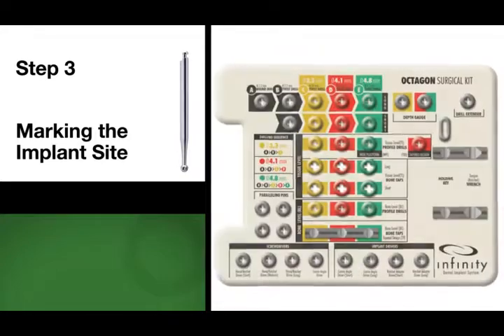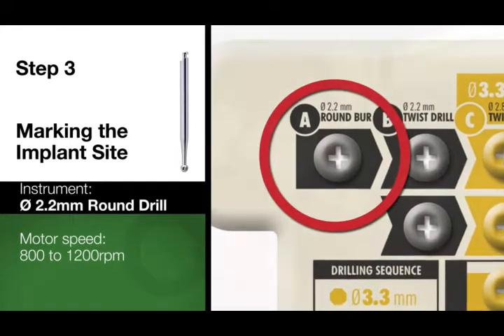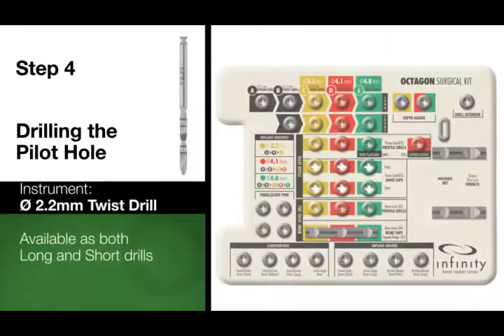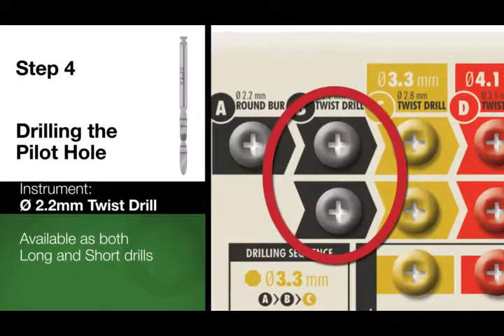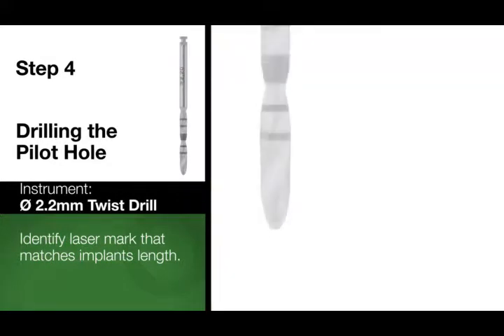Step 3. Marking the implant site. Use the 2.2 mm diameter round burr with a motor speed between 800 and 1200 RPM and copious irrigation. Mark the initial osteotomy. Step 4. Drilling the pilot hole. Before drilling the pilot hole, identify the laser markings on the 2.2 mm twist drill.